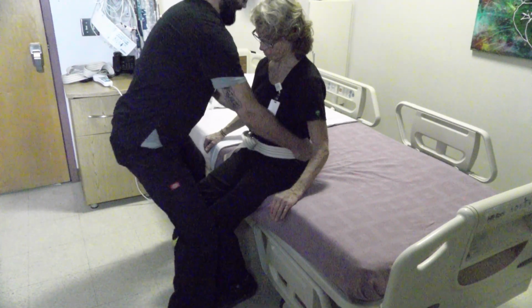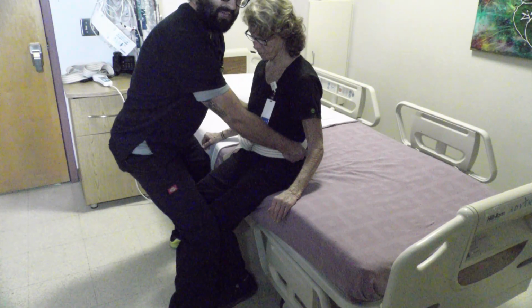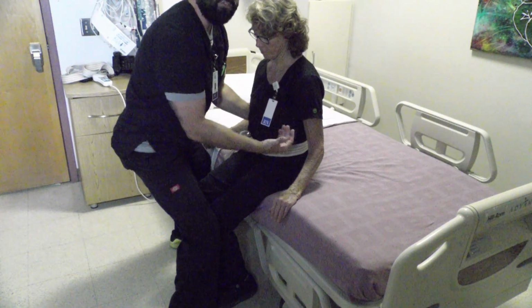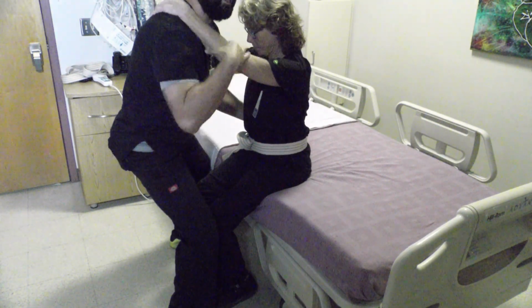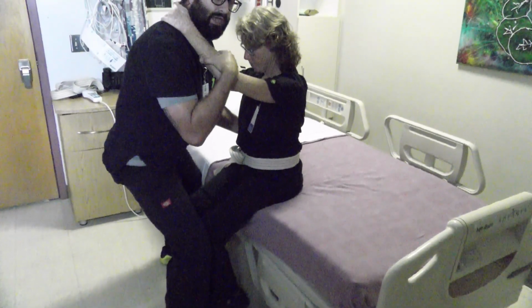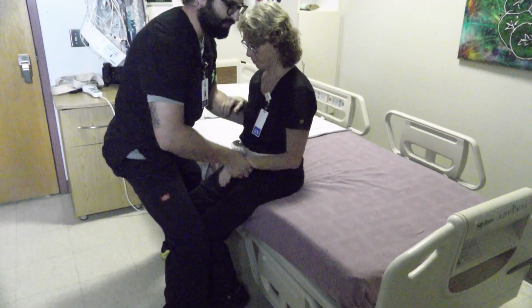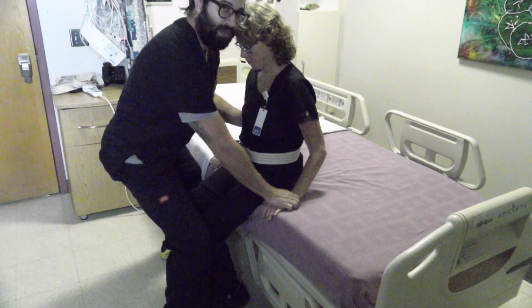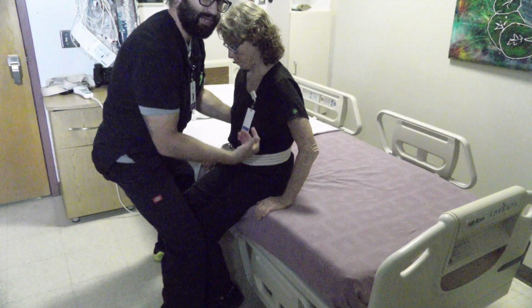All right. Now, you need to think about what you're going to ask the patient to do. A lot of patients just initially grab the top of your shoulder like this, or even the back of your neck. Please be careful with that because they can hurt you. I would ask the patient to keep their arms at their side and actually use their muscles of their arms to help push up. So direct the patient to push up as you stand up together.